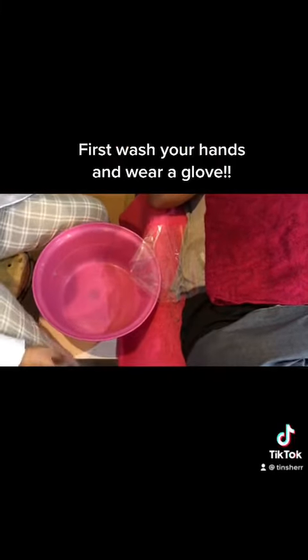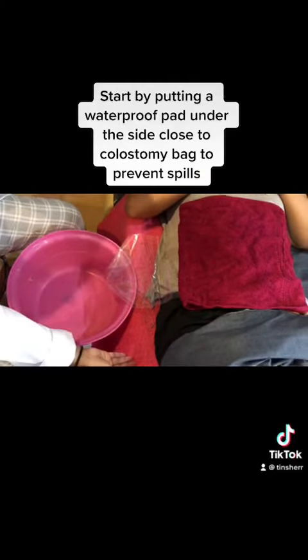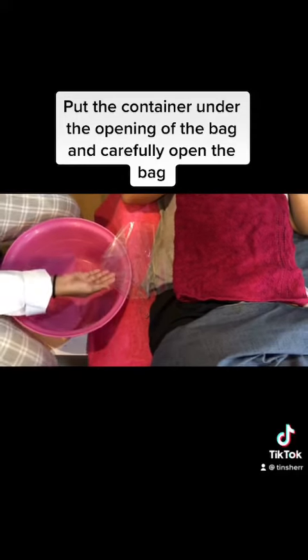So first and foremost, you need to wash your hands. So I already washed my hands. And then you start by putting a waterproof pad under the side close to the colostomy to prevent spills on the bed. So second, you need to put the container under the opening of the bag.